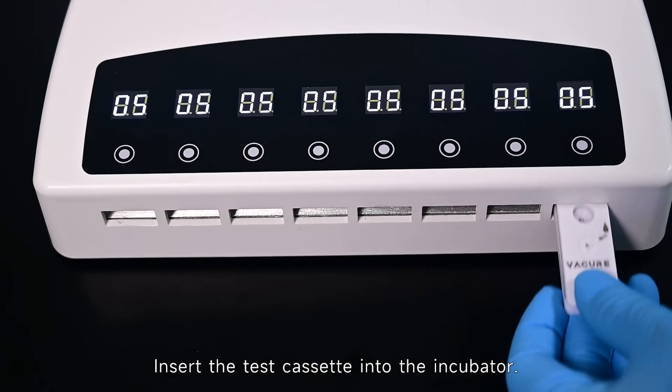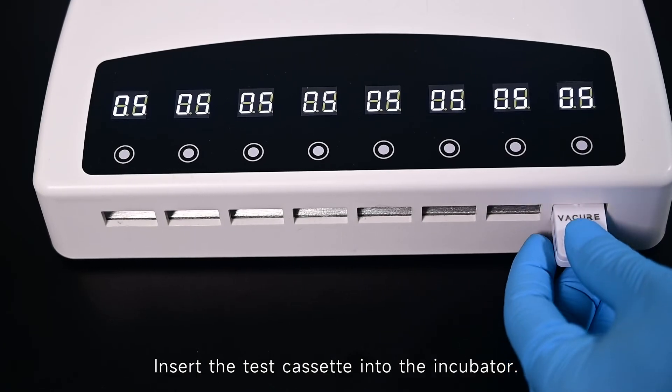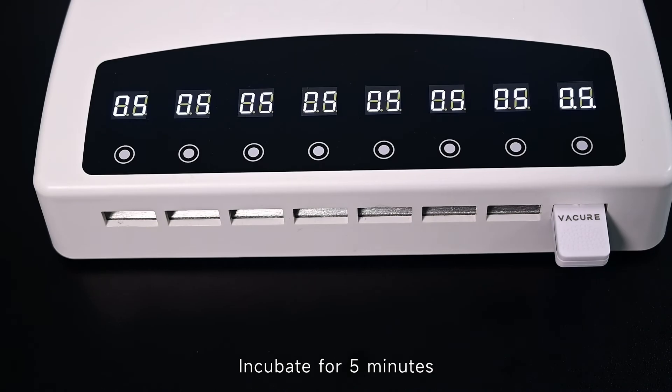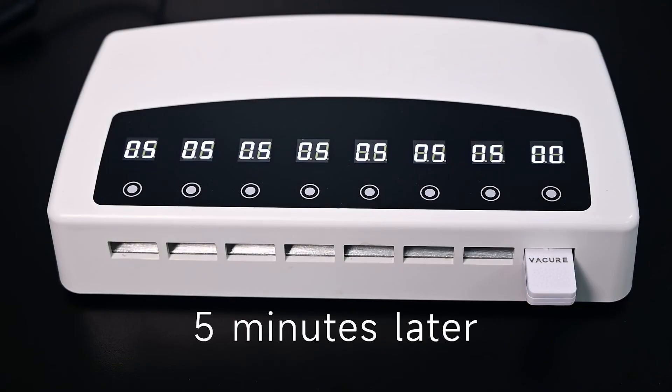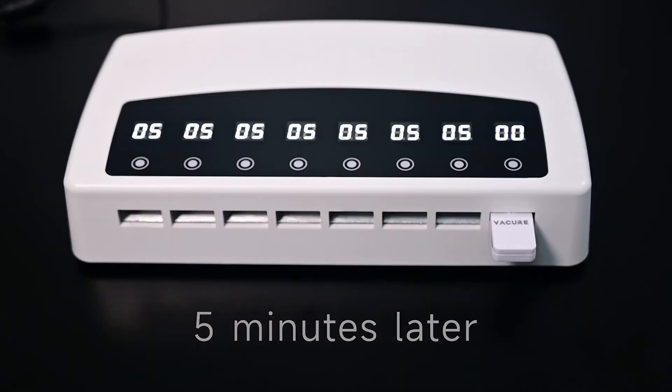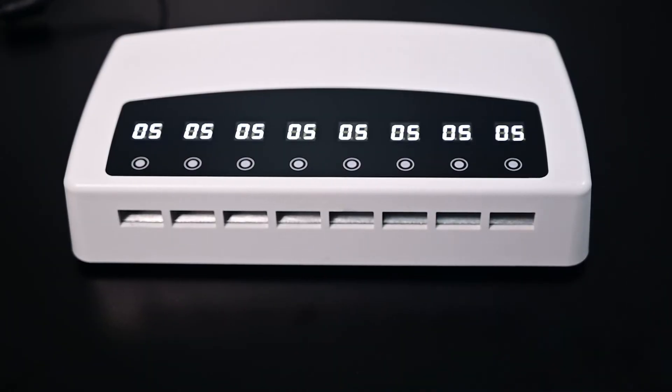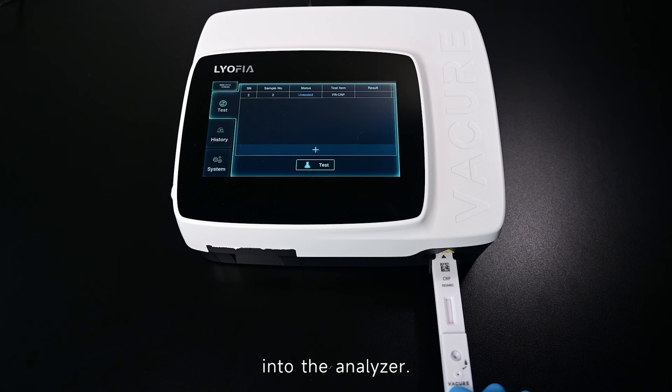Insert the test cassette into the incubator and incubate for 5 minutes. Remove it and place it into the analyzer.